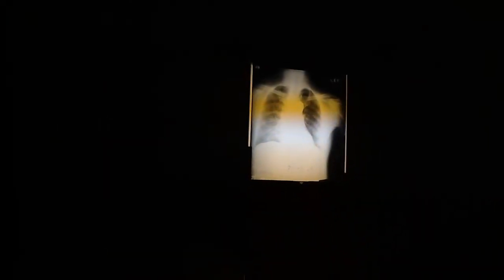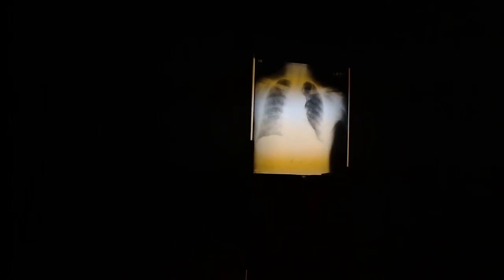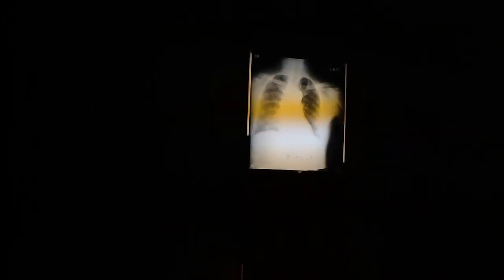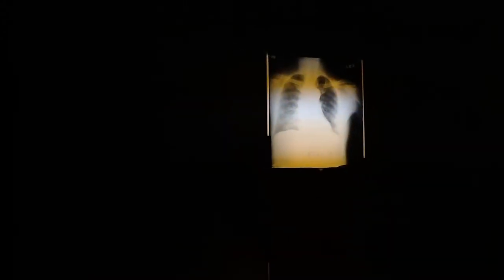Well, we can sometimes get a little bit head faked. This has actually got thousands of dots. But sometimes those thousands of dots can make us think a little bit reticular. But this is really miliary. And how big is miliary? 1 to 2, 3 to 5, 5 to 8 on the small side. Really 5 or less is considered to be a miliary interstitial pattern.